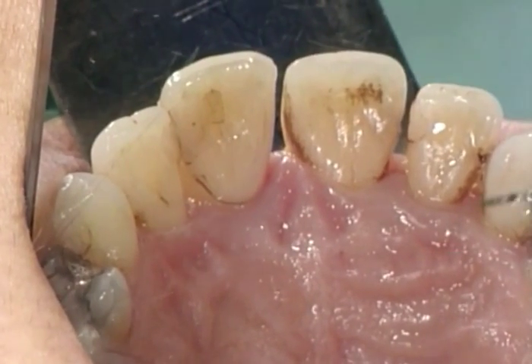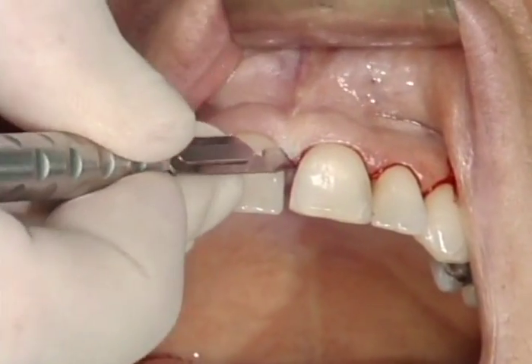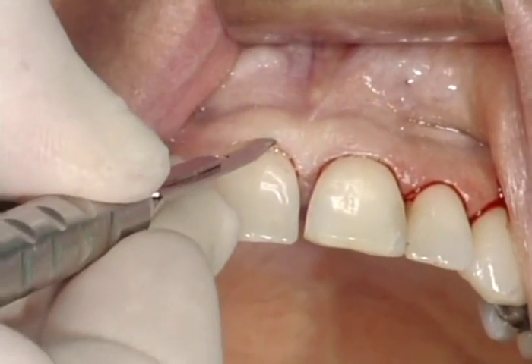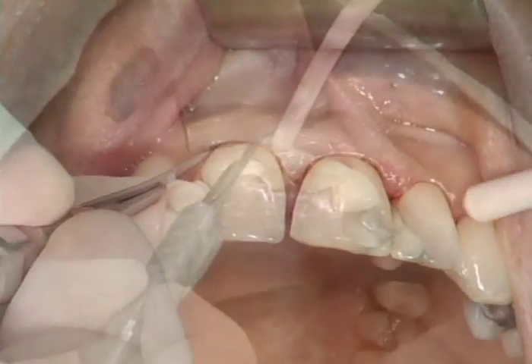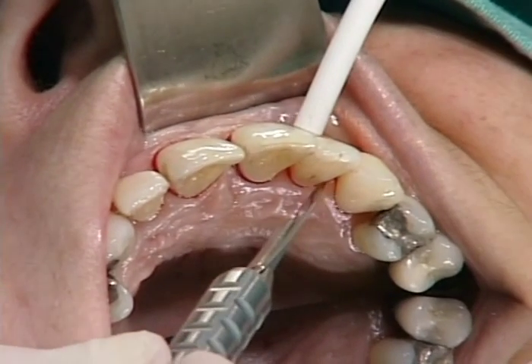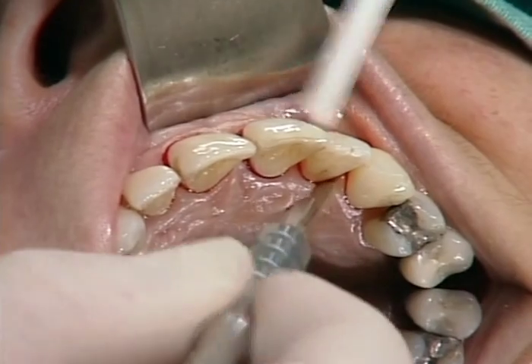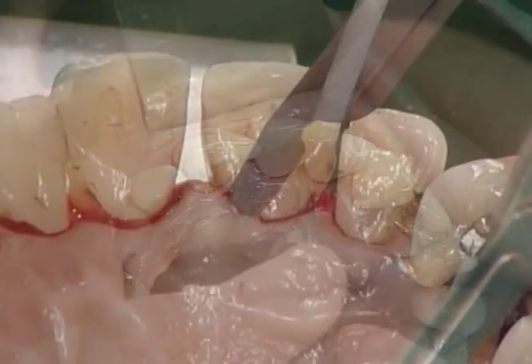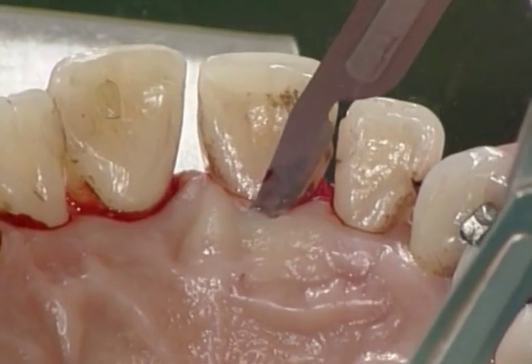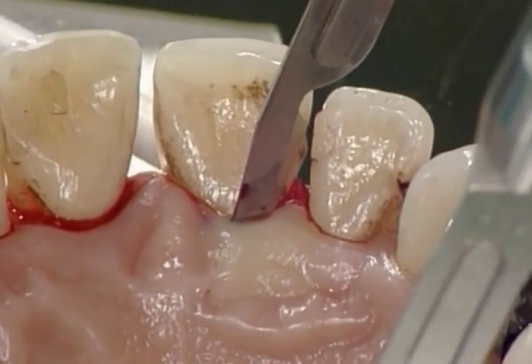The area has been anesthetized by local infiltration. An intracrevicular incision is made with a 15C blade. The incision is extended mesiodistally to allow the elevation of a mucoperiosteal flap. Since there are no relieving incisions, good soft tissue healing can be expected.